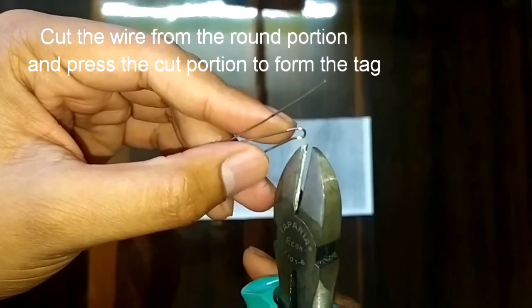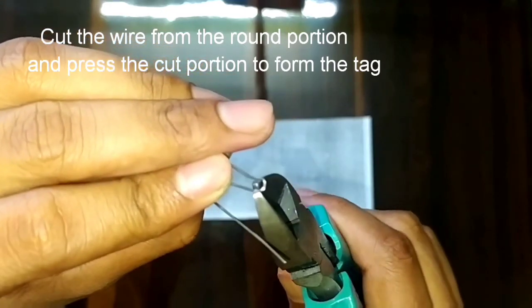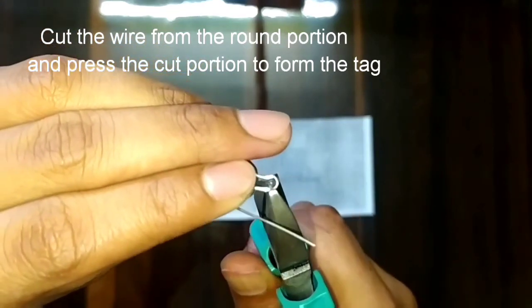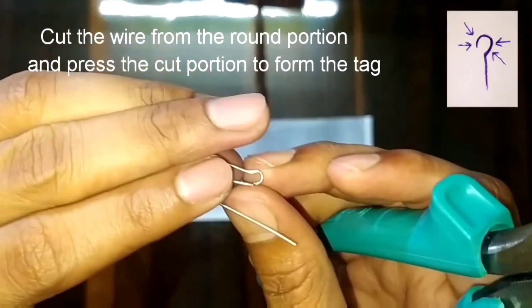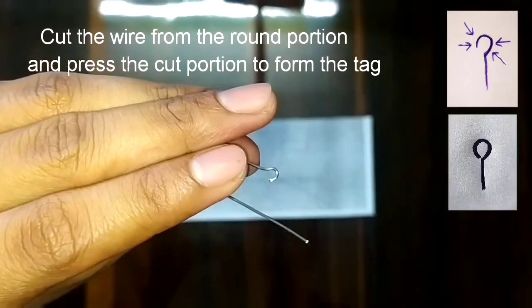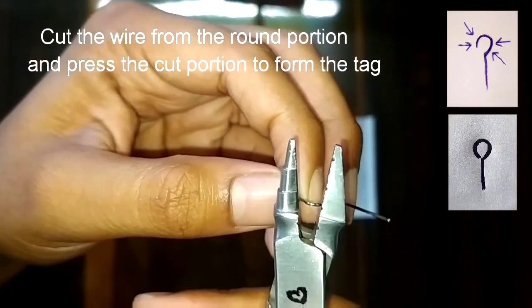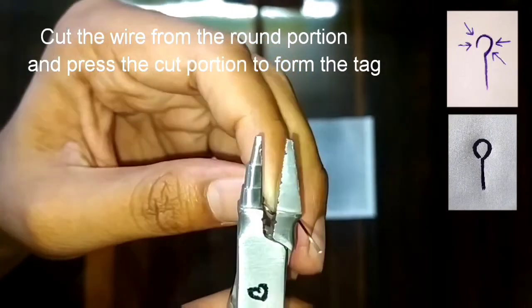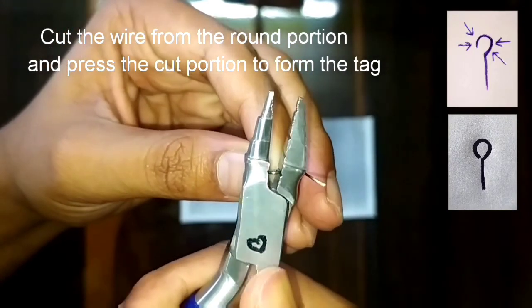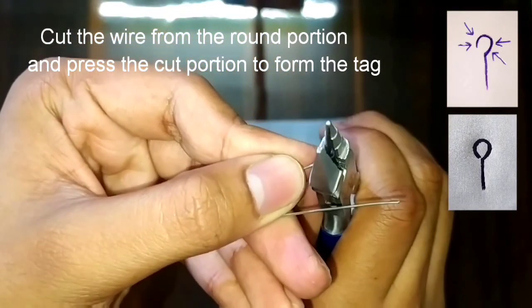After this, we will cut the wire from the round portion in such a way that after the compression of the cut portion, it will form a small tag at that position. We will compress it with the plier. You can see here the small tag is formed.